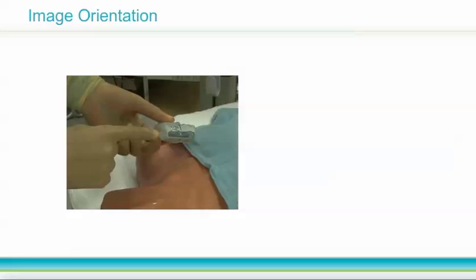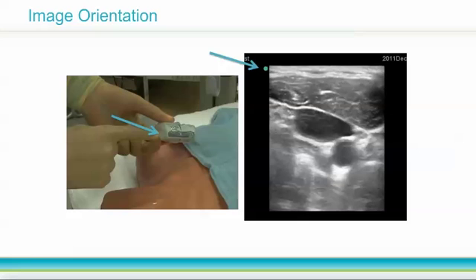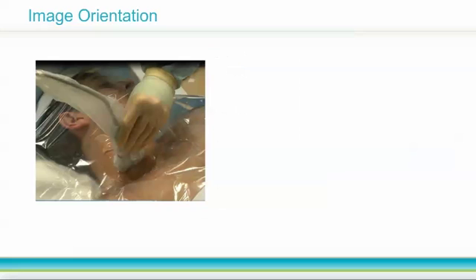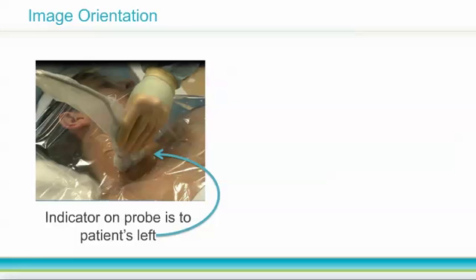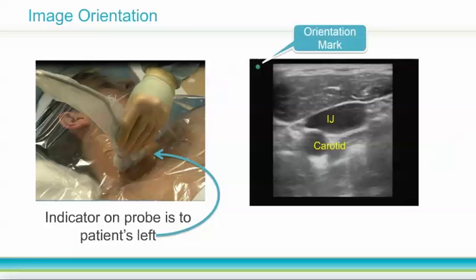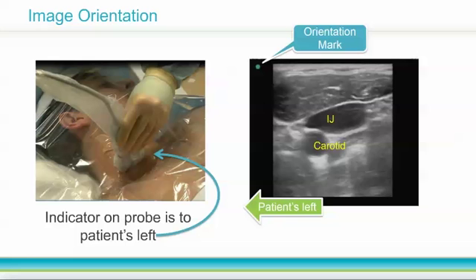Differentiating superficial and deep on the ultrasound screen is fairly straightforward, but left and right depends on how you hold the transducer. Each transducer has an indicator of some sort on one side, such as a groove or a raised dot. This indicator corresponds to the orientation mark on the ultrasound image. We will discuss image orientation in greater detail in the knobology module. For now, keep in mind that you can use this orientation mark to orient yourself to an image on the screen. Here, the transducer indicator is pointing to the patient's left, which corresponds to the orientation mark — the blue dot in the upper left part of the screen — so the left side of the screen represents the patient's left side.